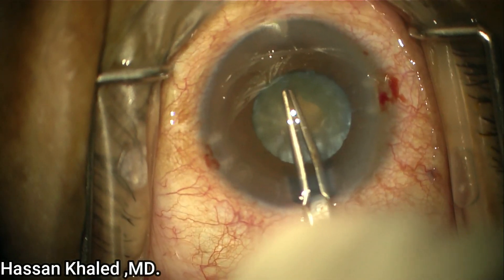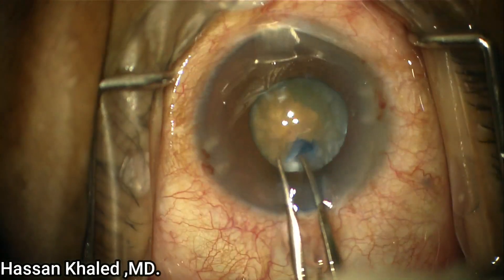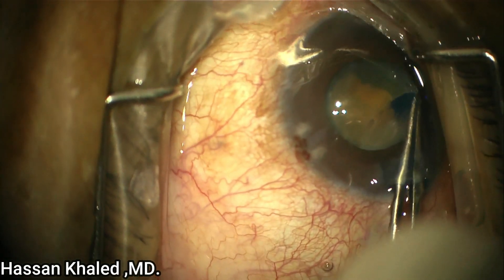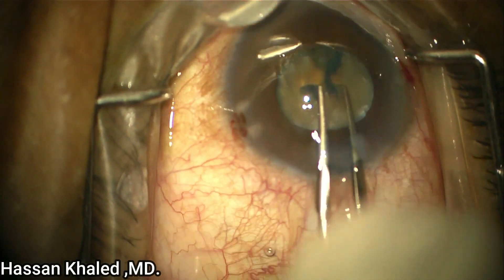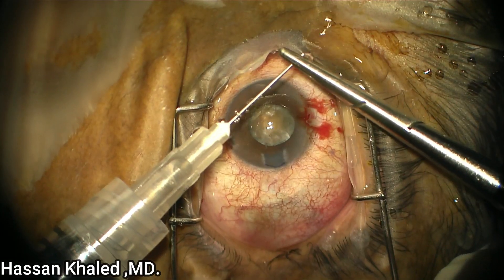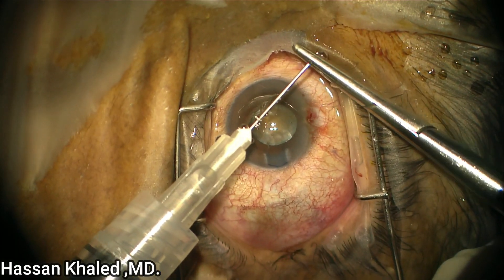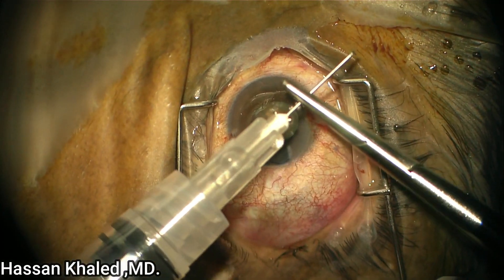I'm using the micro scissor to do a small snip, and here you can see the second large rhexis. You can see the edge of the large rhexis is going parallel with the edge of the pupil. Now I have about a 5mm capsule rhexis.